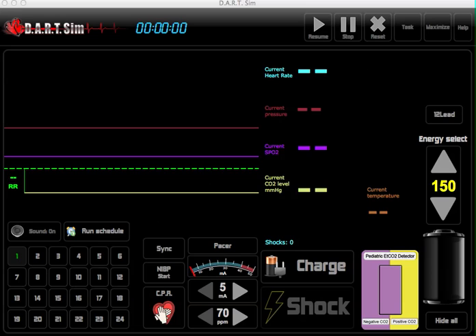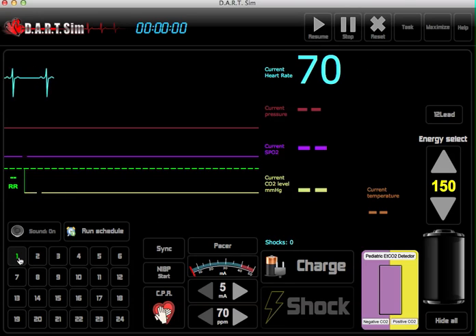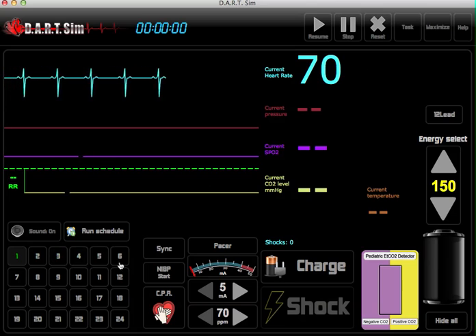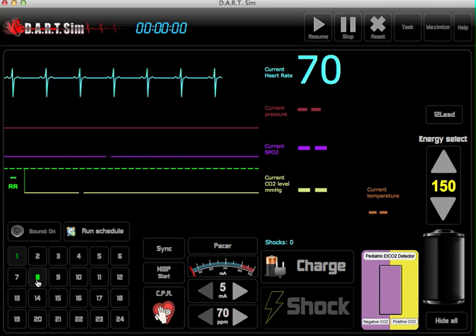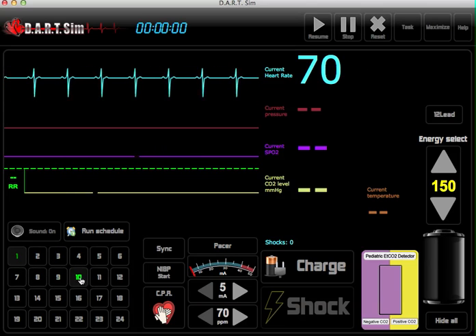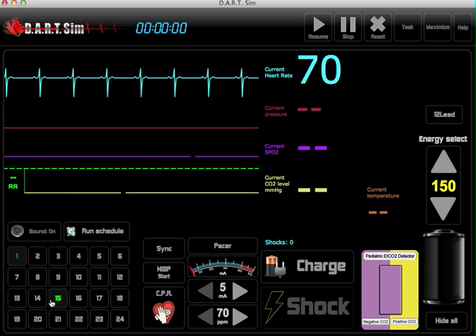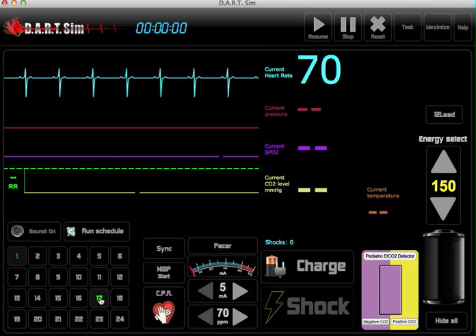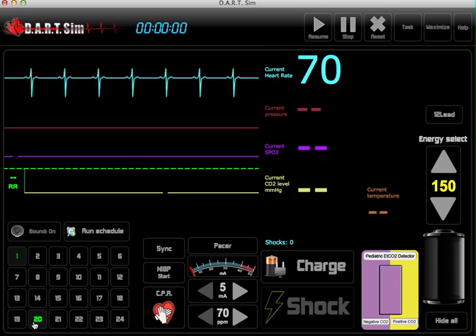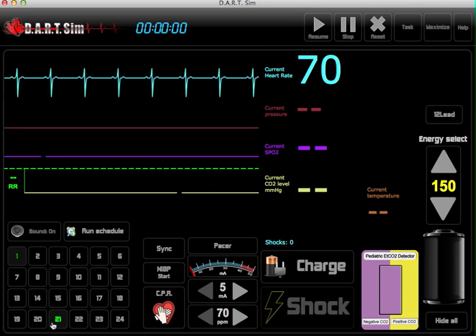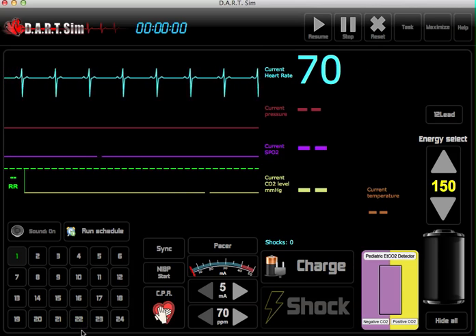Let's first discuss how to operate the Rhythm Generator. We have 24 different cardiac rhythms ranging from normal sinus rhythm to bradycardia, tachycardias, heart blocks, ventricular arrhythmias, and also our ST elevation MI rhythms as well.